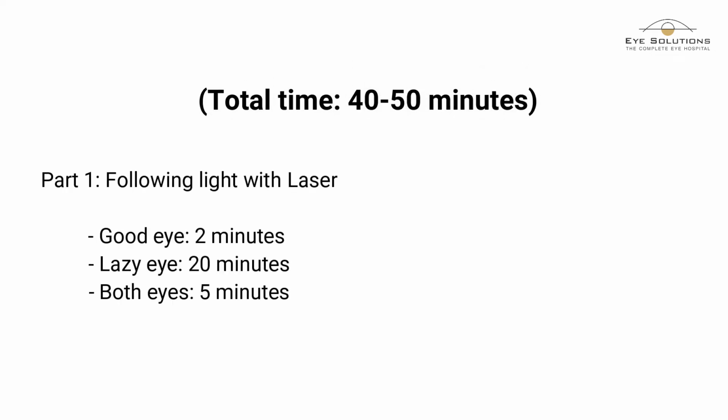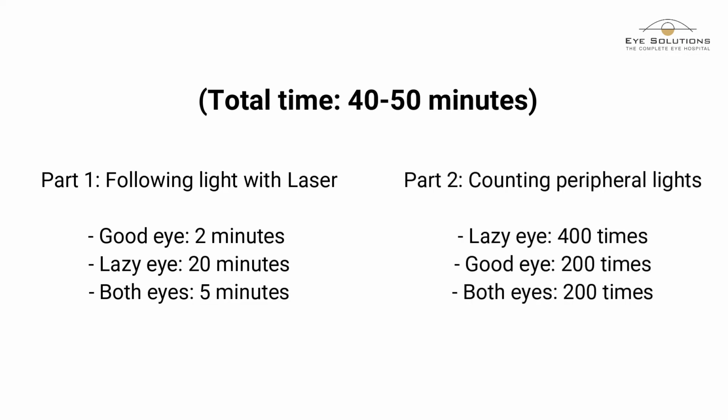Each session lasts for about 40 minutes, and you should note that the number of times that we ask the patient to count the lights would depend on the severity of amblyopia. Your therapist can decide the duration of therapy based on the child's vision and severity of amblyopia.